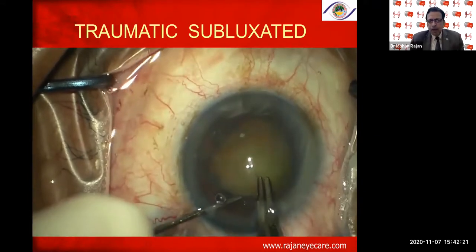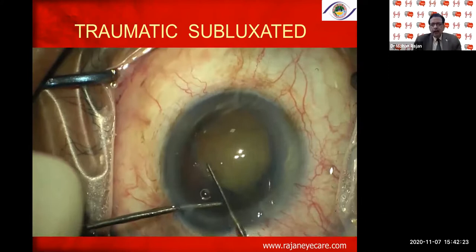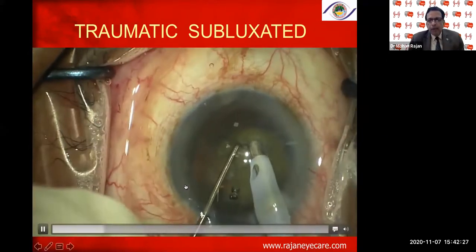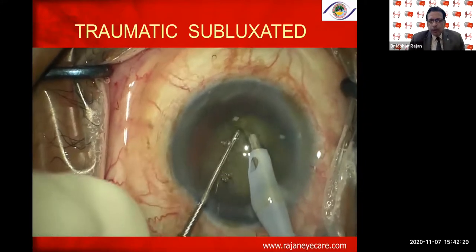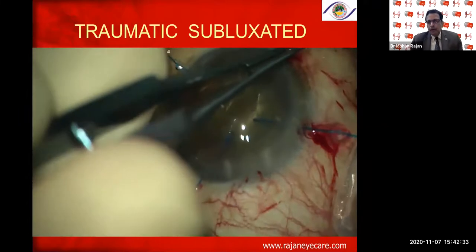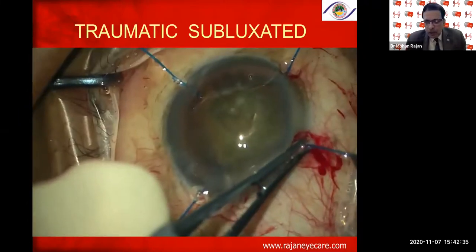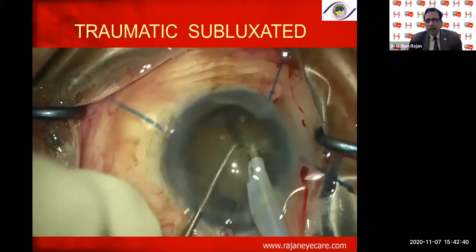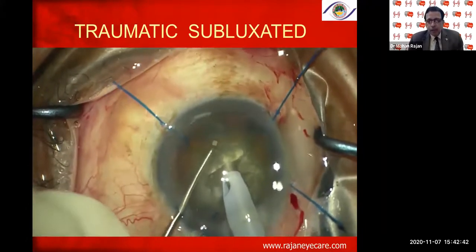When I started the phaco emulsification, all of a sudden I found that the nucleus is very wobbly. The nucleus is moving around in the bag. So I went ahead with the iris hooks. You can use iris hooks for the capsular bag, but there are capsular hooks which are very, very special, which are available and can be used for the capsular bag.